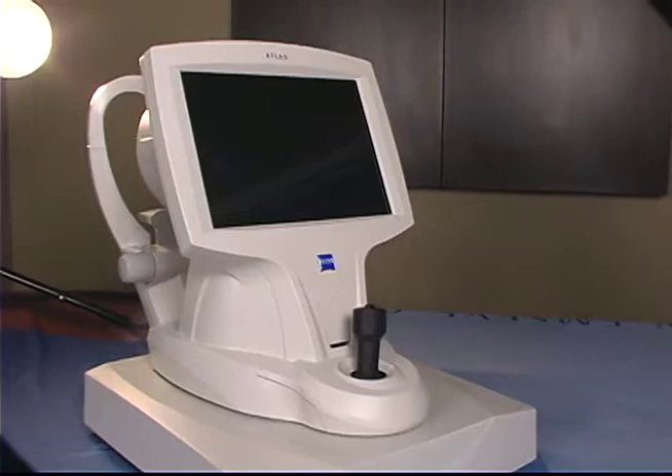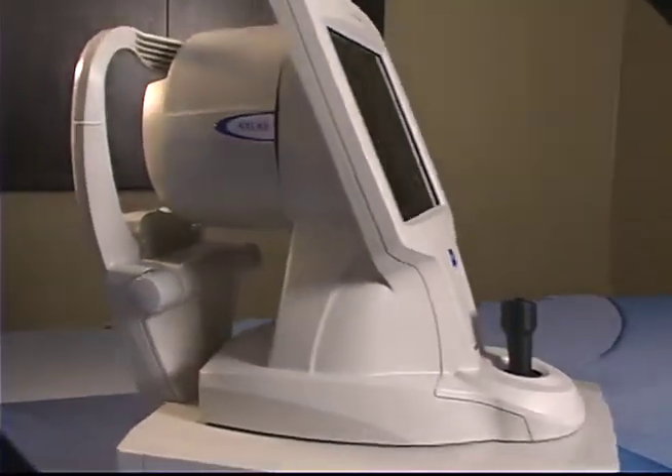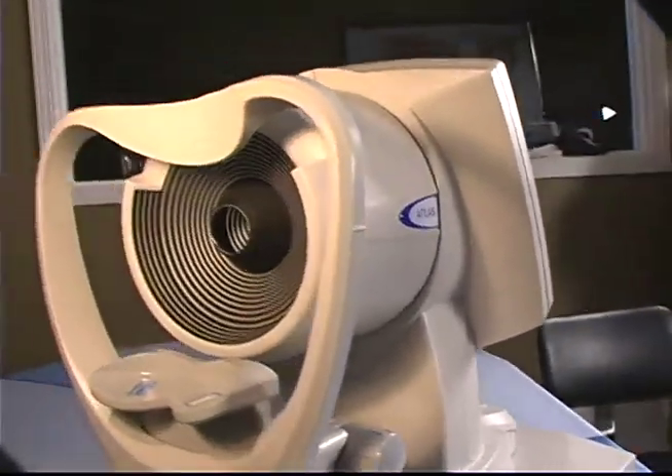Corneal topography provides a detailed and visual description of the shape and power of your cornea. These details are used to diagnose, monitor, and treat various eye conditions.